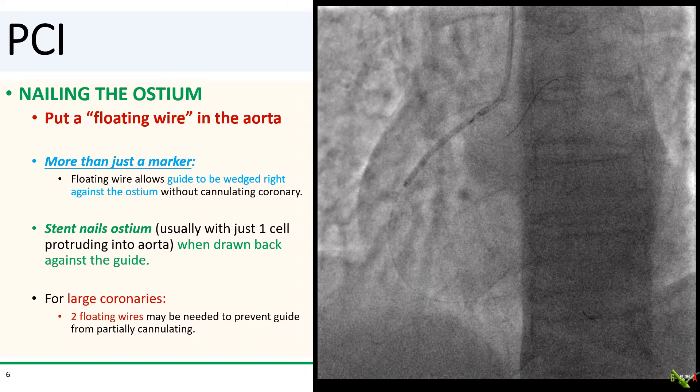So I needed to stent the ostium to close up the dissection. As we all know, precisely placing a stent at the ostium is a little tricky, and often you are injecting contrast in different views to find the ostium. But when you have a dissection, it's actually important to minimize contrast injection since more injections can worsen the dissection. So how do you nail the ostium without using contrast?